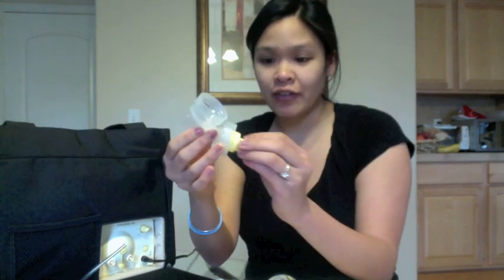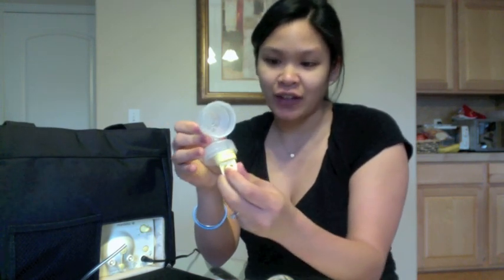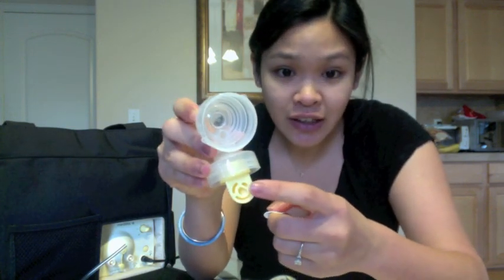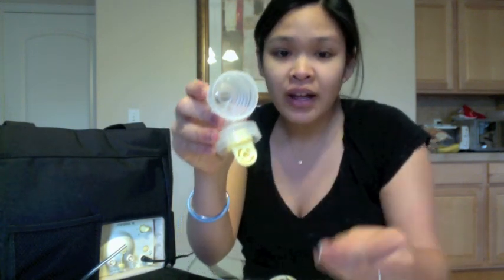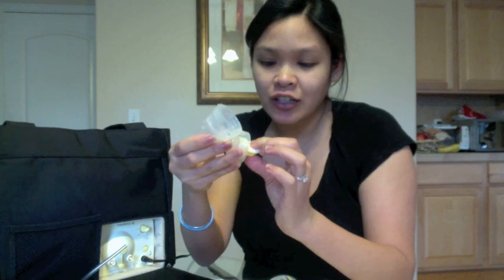So just take your valve and go ahead and place it in. It doesn't matter which way this open part is faced, it doesn't have to face the other opening or backwards or anything. As long as it's on, it'll work. Make sure you take your membrane. If you can see, there's one little hole, that's where the little sticking out part of the membrane goes into. So pretty easy. You just push it back in, and as long as it's pretty flush, it'll go ahead and work.